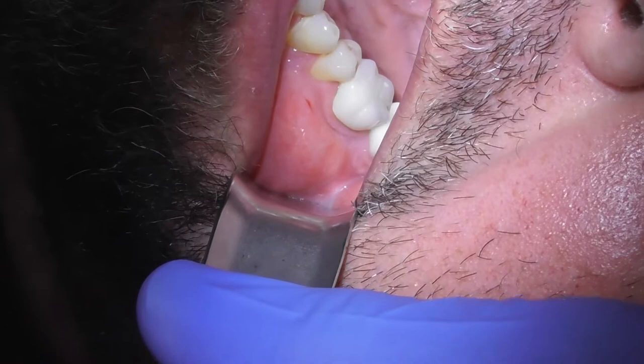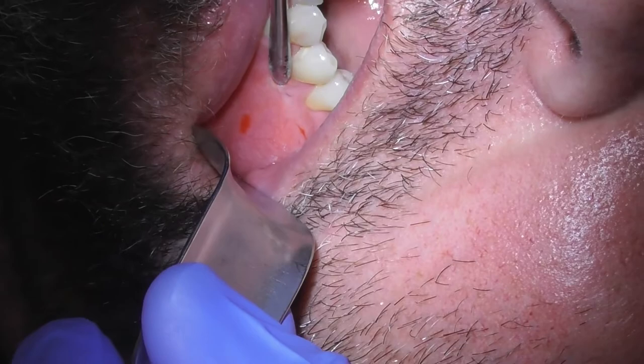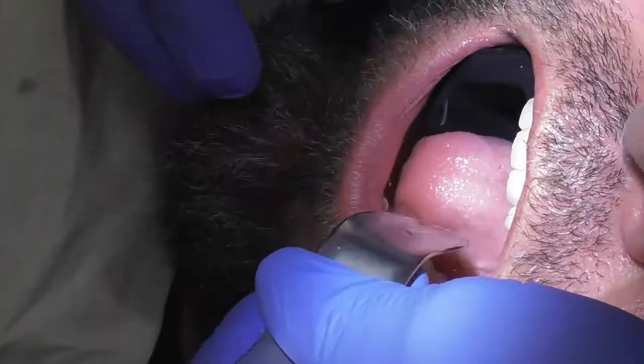All right, let's get that periosteal elevator. I'm just going to touch the area again — we've got to make sure you're good and numb before we do anything. When I do this, all you should feel is pressure. Is that true? Front part, kind of up here — do you feel that a little bit? Okay, let me give a little more local there too.